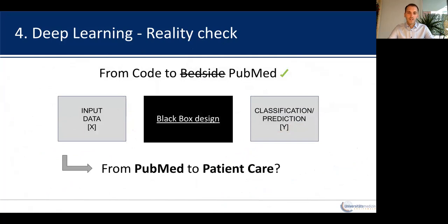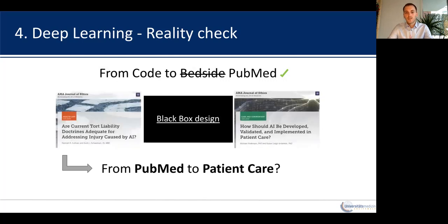We believe that the black box design is a major limitation to clinical translation, as black box is a term for the description that deep learning systems might outperform radiologists in a certain task. However, they are not able to display their decision-making and justify their decisions. So it will be difficult for clinicians to just accept the deep learning system, which is supposedly better in the task than the radiologist or the clinician themselves. The black box design is also connected with doubts in ethical and legal aspects, which are, in our belief, one of the major barriers to a clinical translation of these deep learning systems.